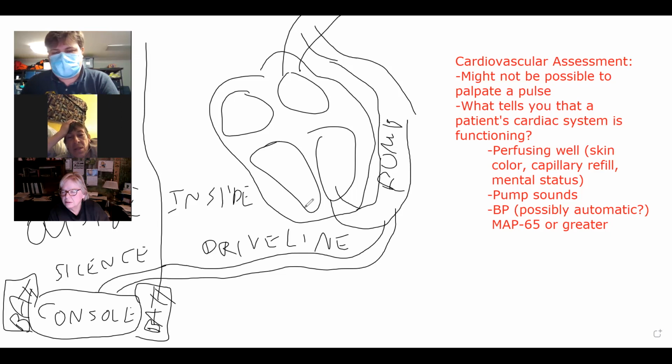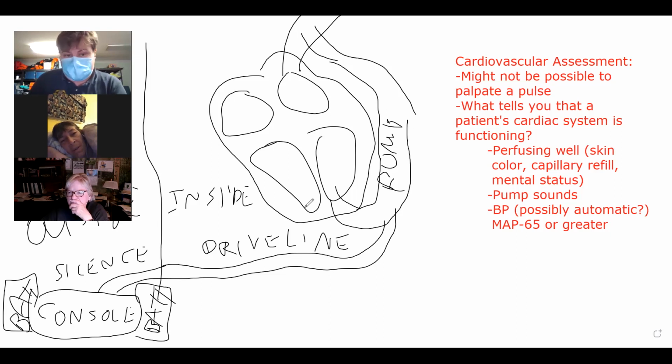Yeah, so I think that is a one. Maybe I'm not articulating the question right. No, I think you are. So basically, I think what you're trying to say is you have someone who's unresponsive, their pump is dead, and you are troubleshooting it appropriately, like we just walked you through. You replace the batteries, but you're not certain how long the patient has been down for. And now you're restoring blood flow to someone and you're not sure how viable that person is, depending on how long they've been out for. Is that kind of the scenario that you're painting for me?